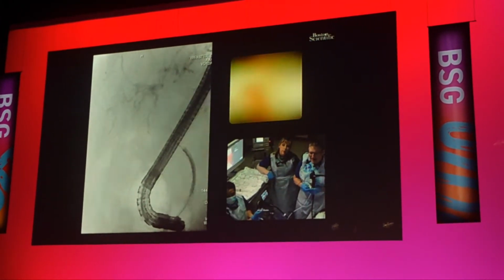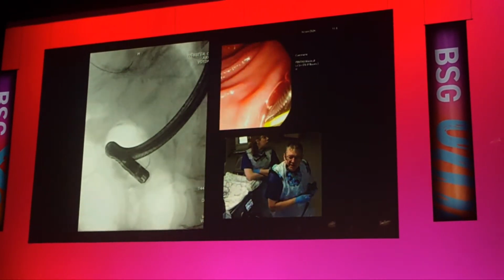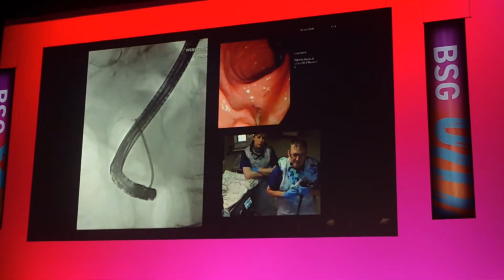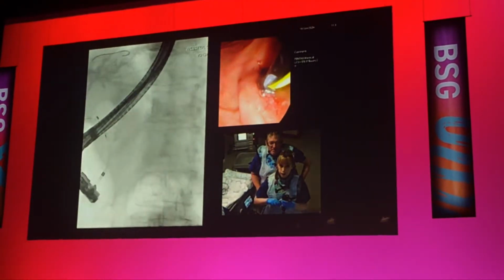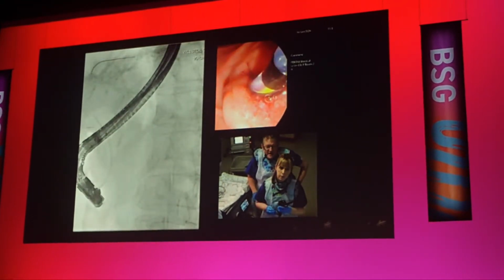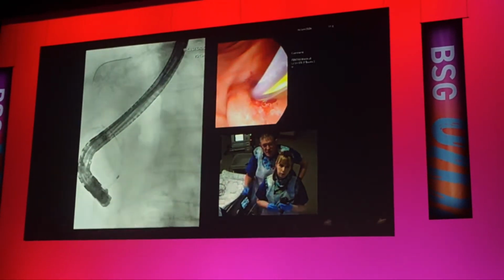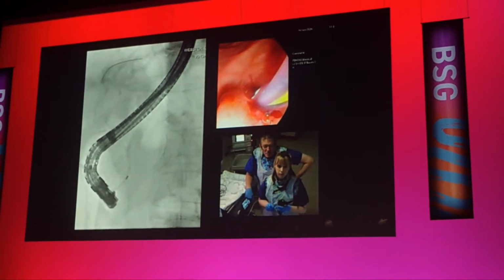Because we want to maximise tissue acquisition, we went on to do endobiliary biopsies over a guide wire. It's important to ensure here that you're putting them over a wire, using fluoroscopy, and you're below the ampulla when you're inserting these biopsy forceps, which can sometimes be difficult to get into the duct. And then finally, as a third method of tissue acquisition, we're doing brush cytology, pushing the brush up above the stricture, opening the brush and pulling that down as it's opening into the stricture. And here we have the three modalities to maximise our tissue and maximise getting a diagnosis for this patient.